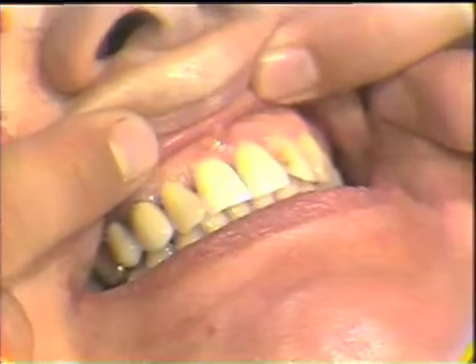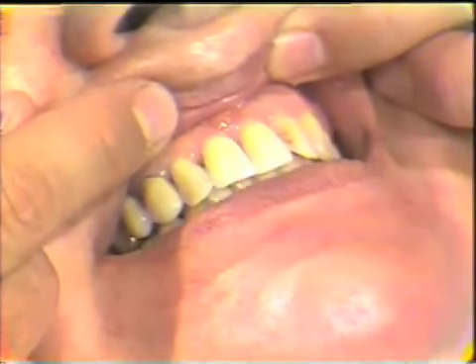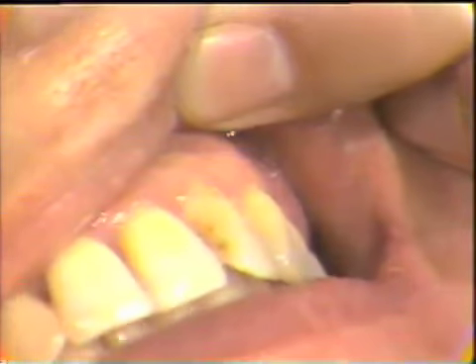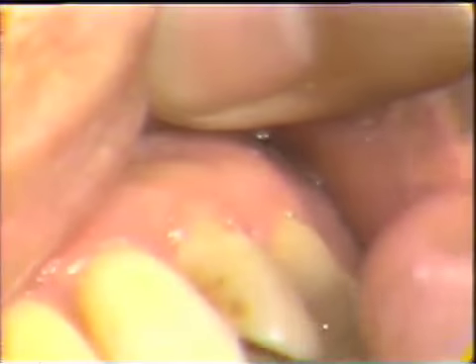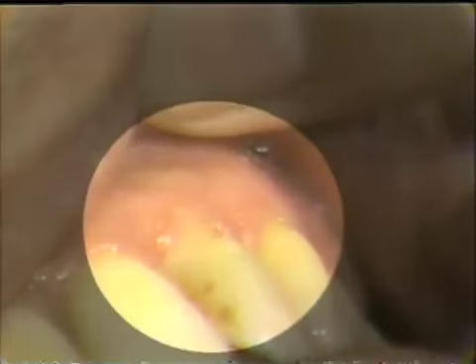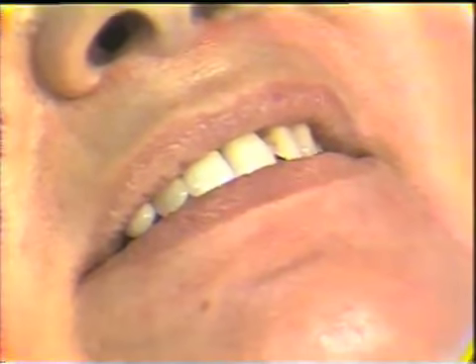Another thing of interest on this patient is if you'll tap, just tap up and down. If we look at the lateral incisor, just keep tapping, we'll see a blanching of the tissue in this area, and I can visually see the tooth moving. So we should do an occlusal adjustment on this patient before any type of mouth preparation or any type of abutment preparations are fabricated.